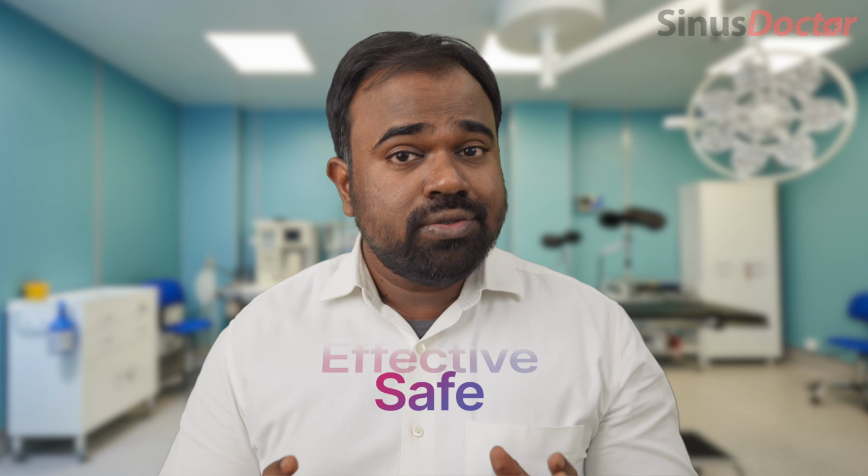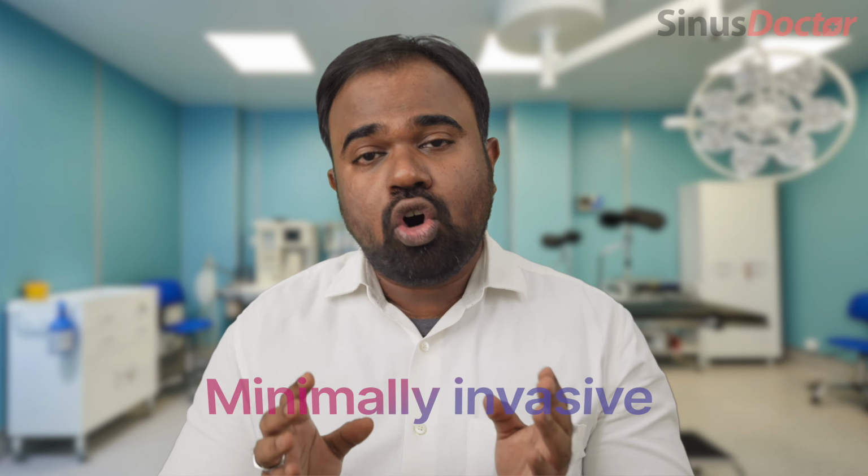In conclusion, I can say balloon sinuplasty is a safe, effective, and minimally invasive alternative to traditional sinus surgery. If you or your loved ones are suffering with persistent sinusitis symptoms, it is advisable for you to have a discussion about balloon sinuplasty with your ENT surgeon. Remember, there is no need to suffer in silence with chronic sinusitis symptoms. You can use options like balloon sinuplasty to breathe easy again.